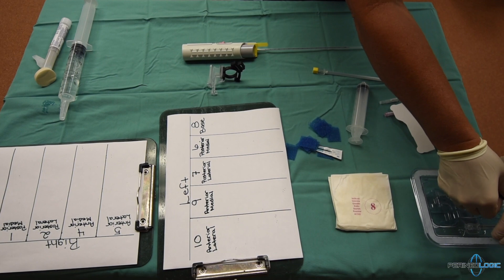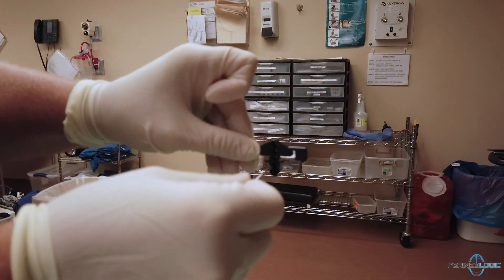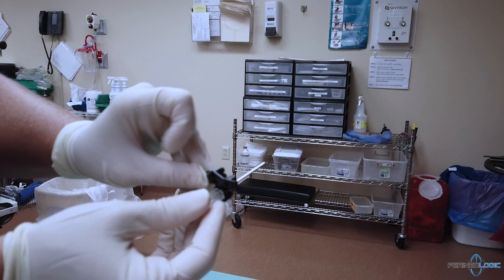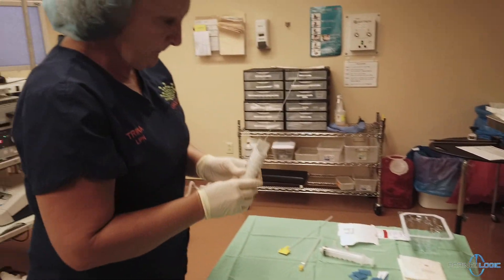We assemble the Precision Point carriage and load the access needle into the aperture second from the bottom, but this will differ depending on the preference of the surgeon. Next, we make sure to load the biopsy gun.